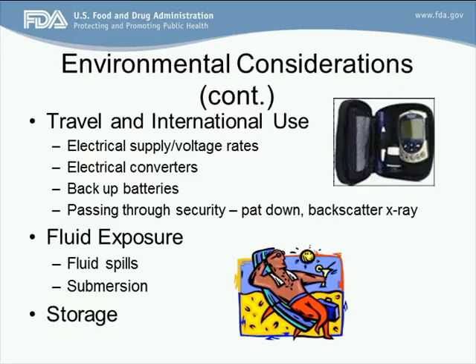And then finally looking at storage. Can it be stored in the sun? Does it have to stay out of the sun? Can it be in a very warm environment? Can it be in a closet? Can it be stored where the pets are and there's no problem? Just also keeping that in mind as you're designing your device.